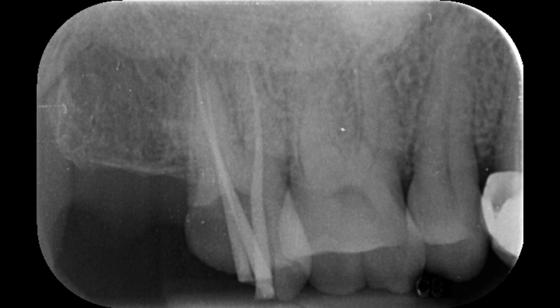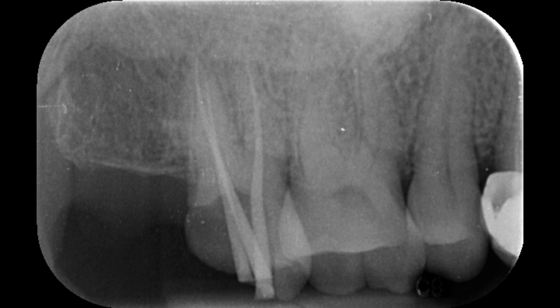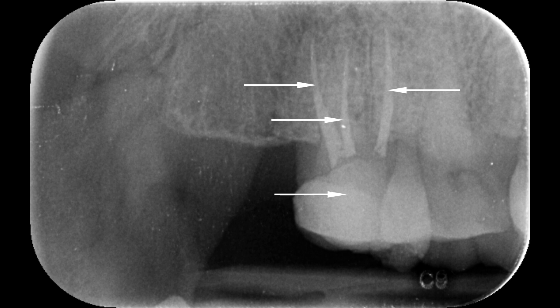After that I completely obturated all three canals and restored the tooth with composite restoration. This is my final distal view radiograph where you can see all three well-obturated canals — this is the meso-buccal canal, this is the disto-buccal canal, and this is the palatal canal. And this is the permanent composite restoration.